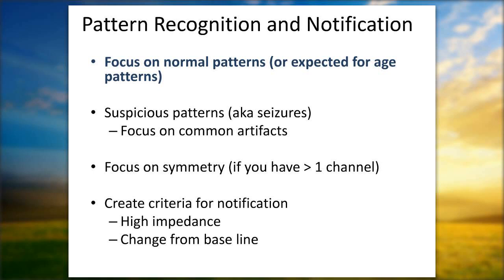So because we know there is such a benefit to cooling, I don't think that we need to use aEEG anymore as a single rule in, rule out. But in the beginning, when we didn't know its safety, I feel like aEEG was a really smart way for us to choose infants with the most potential for benefiting. But I don't know that it's really relevant anymore.